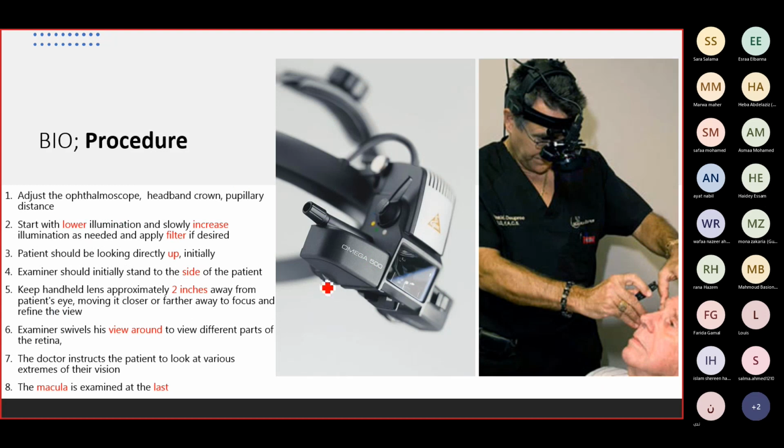So you start by adjusting the eyepiece, so you can move those eyepieces closer or further away from each other till you are having them adjusted for your IPD. What we usually do is put our finger at the working distance here, so the aerial image is expected to be somewhere here. So I put my thumb here and I have one eye shut and I adjust the eyepiece for the left eye first, and then I have the left eye shut, and keeping the finger at the same location, I adjust the eyepiece, moving it closer or further away till I have a clear image, and then I open both eyes and I make sure that the image of my thumb is clear with both eyes. Okay.